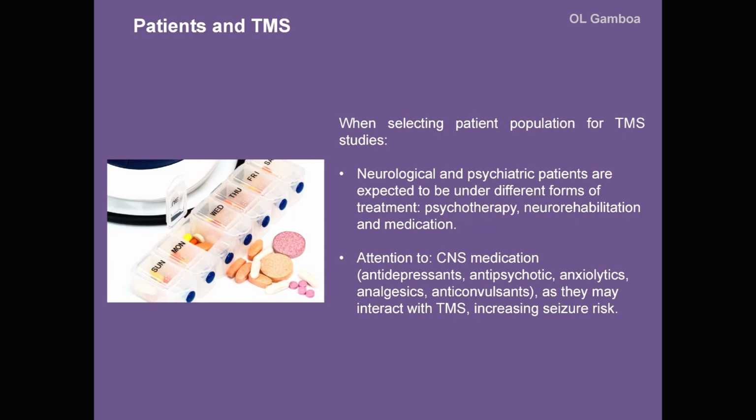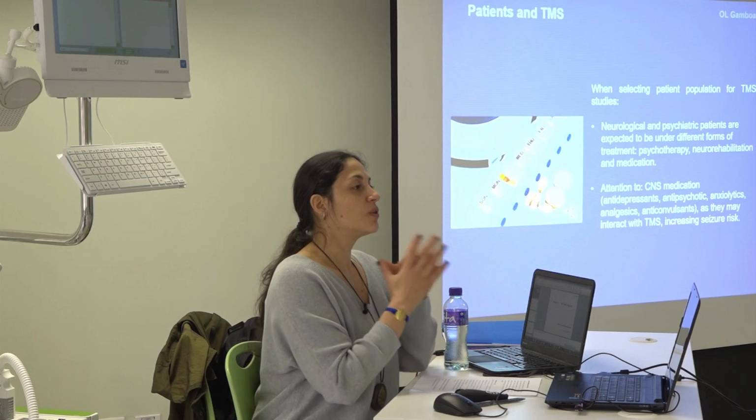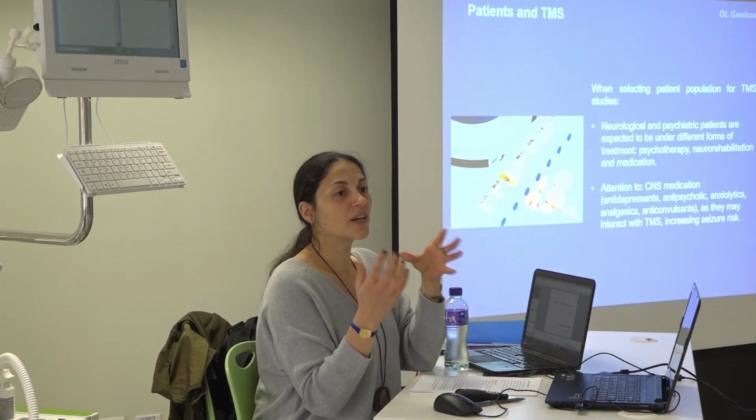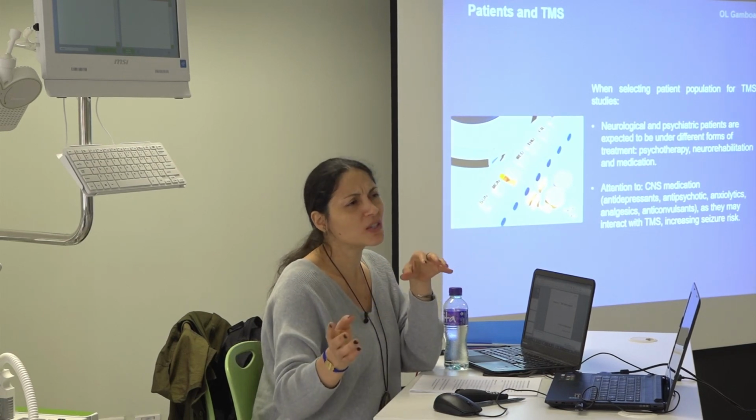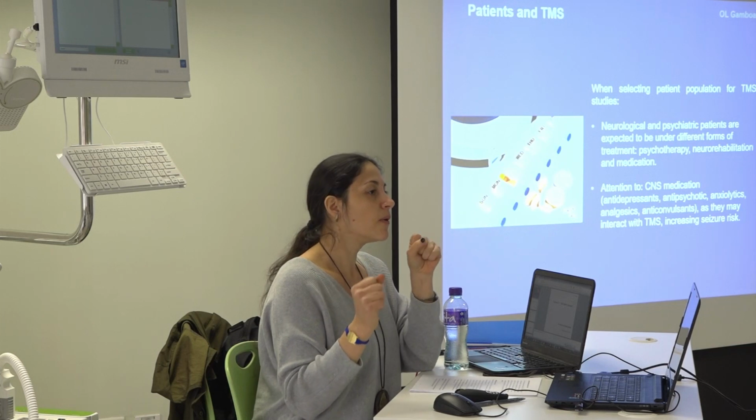So, when you are selecting, obviously here we are talking about patient population, because in some cases you will work with patients. You always need to expect that when you are working with patients, they are taking medication. You need to have this in mind. Don't think, maybe they are not taking it. You need to think that not only are they taking medication, but probably they are following other types of therapy. This can interfere with your experiment or with your treatment. You need to consider this when planning your experiment.